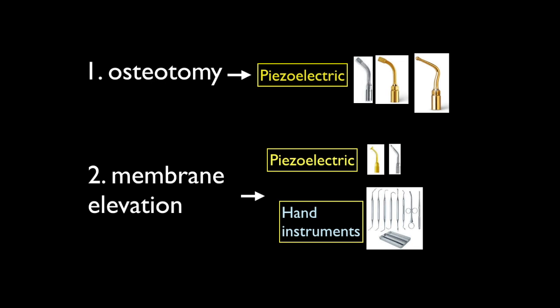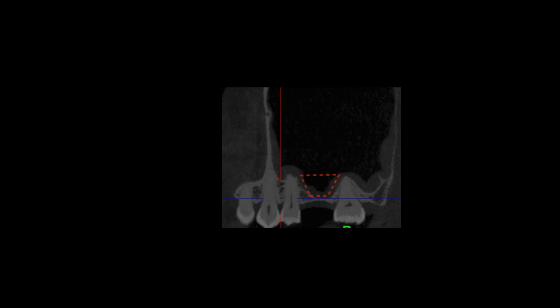Once the membrane is mobile enough, we will fill the space created with Bio-Oss particles and cover and close the operated area. Our aim will be to create a lateral window of a trapezoid shape with a small basis on the floor of the sinus and a slightly wider upper margin. Using local anatomy to mark our entry points, the intention is to have a window approximately 8 mm in height, giving very good access to the lateral walls of the area to be augmented, defined by the roots of the neighboring teeth — allowing us to regenerate approximately 8 to 10–12 mm of height within the sinus.